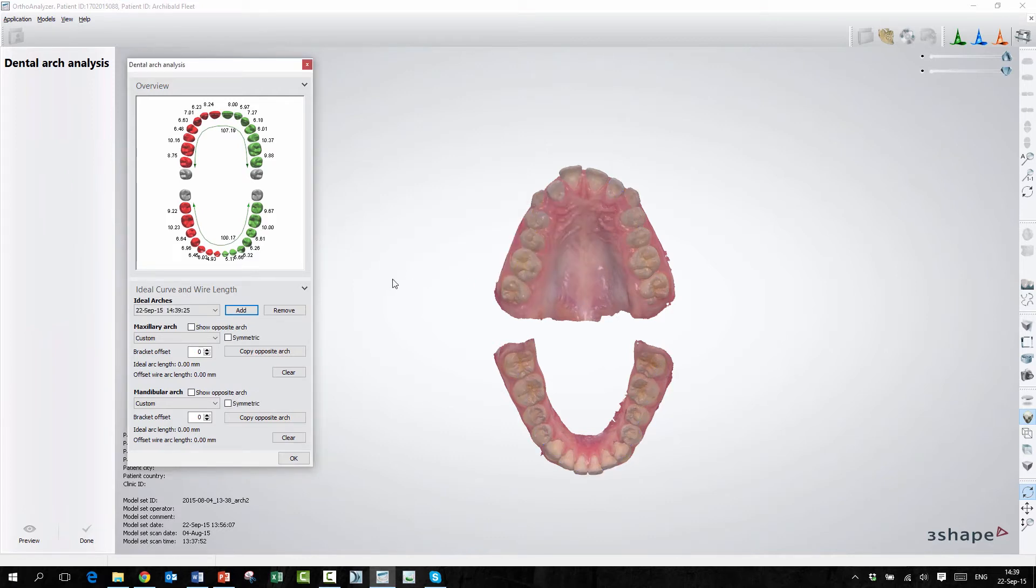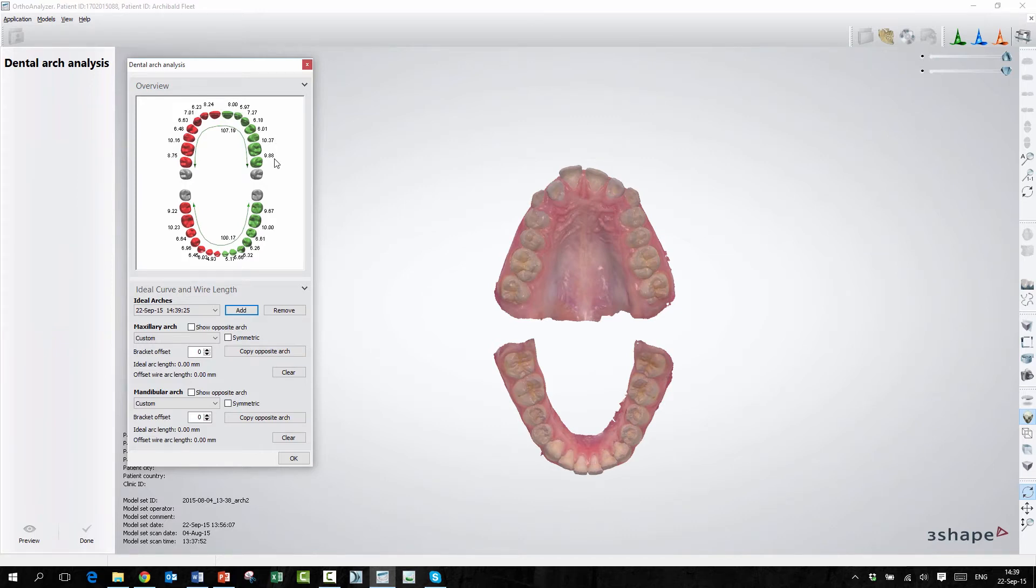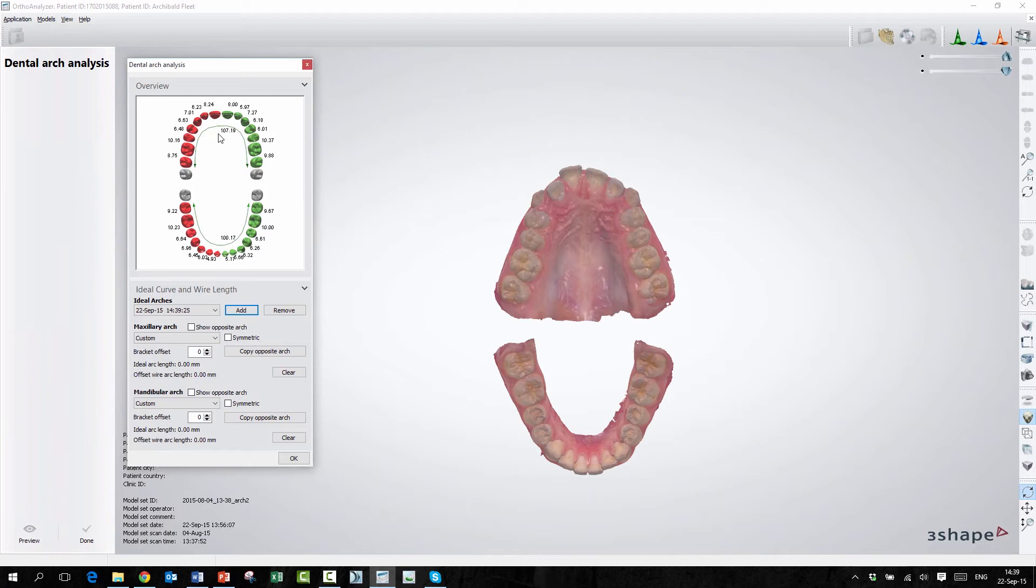Over here, you probably notice there are some numbers. These numbers are the size of each tooth. So if you've segmented your teeth, the numbers will appear. So you get that for free, basically. But if you haven't segmented your teeth, there will be no numbers. And we obviously have a separate video on teeth segmentation.